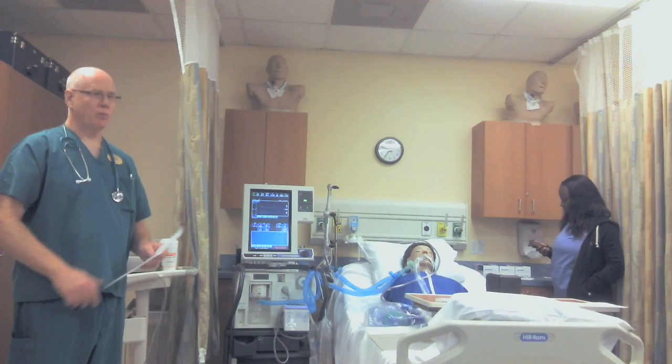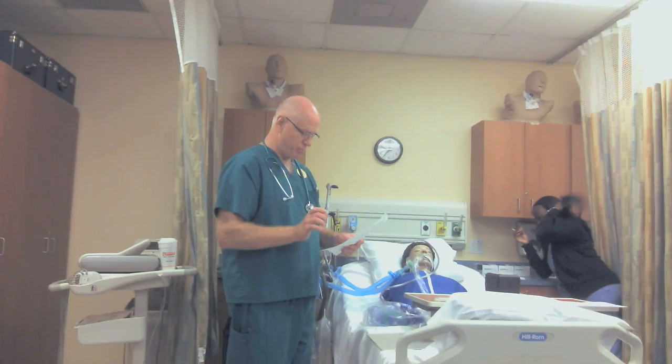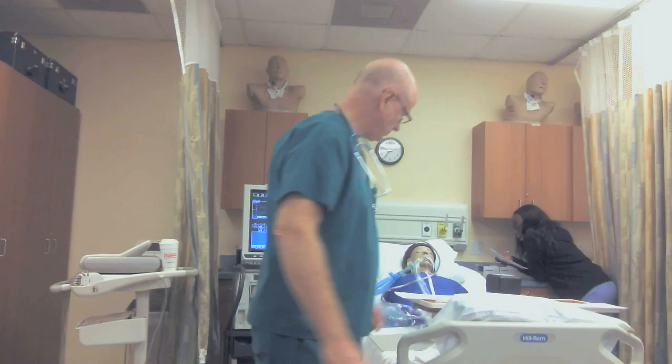Alright guys, we ready? Alright, we're moving on to number 12. At number 12 it says: perform endotracheal tube cuff minimal occluding volume. And then this is very important — suction mouth prior to procedure and record the volume on the flow sheet. Alright, so let me show you how that's done.